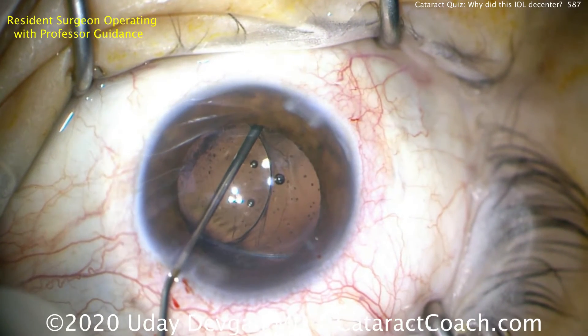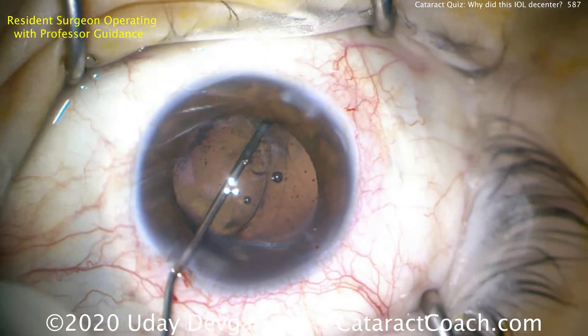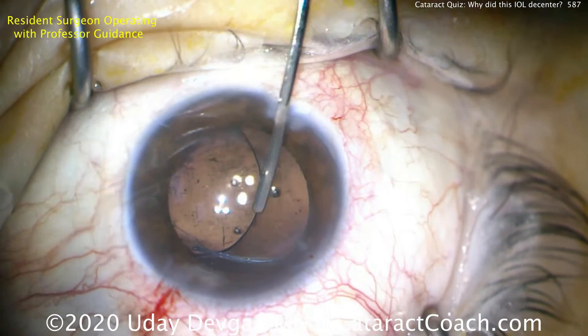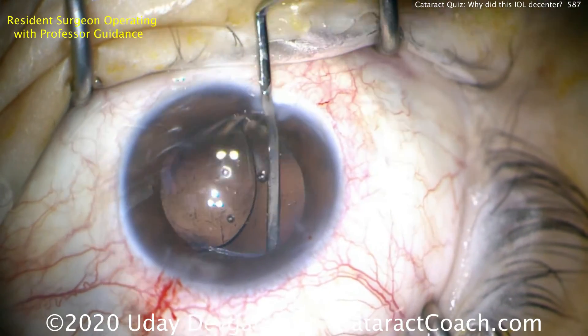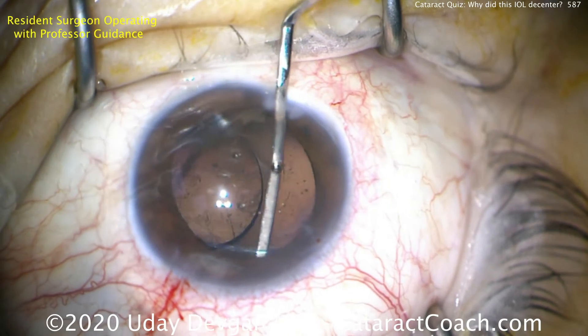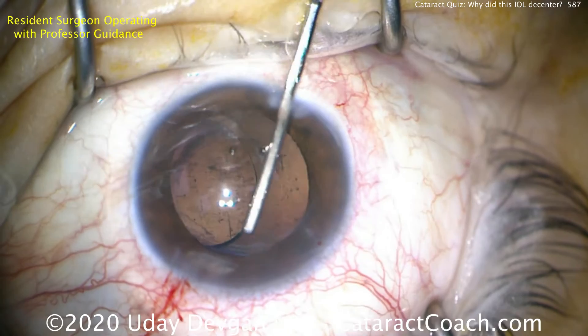If you really have a hard time getting underneath the edge of the rhexis, you can use a 25 or 27 gauge needle on the viscoelastic — just be careful not to damage the capsule. Now the capsular bag is inflated; we'll use the spatula here to try to mobilize that IOL, being careful not to damage the capsular tissue.